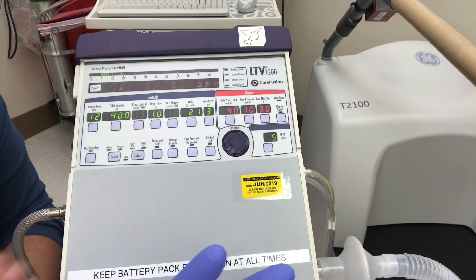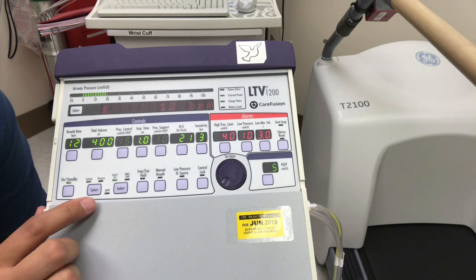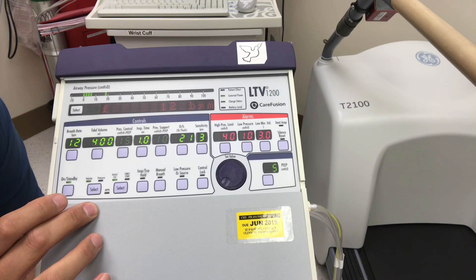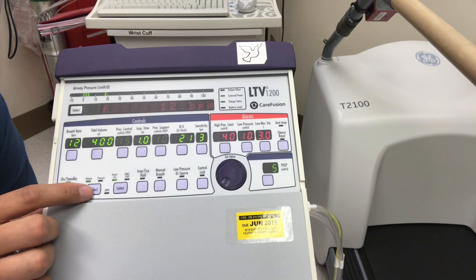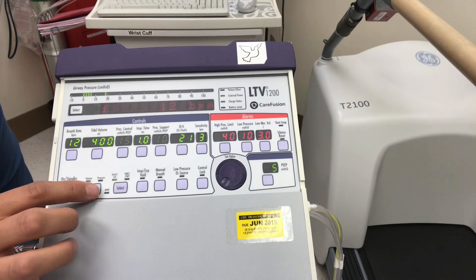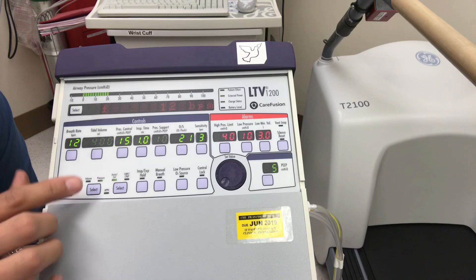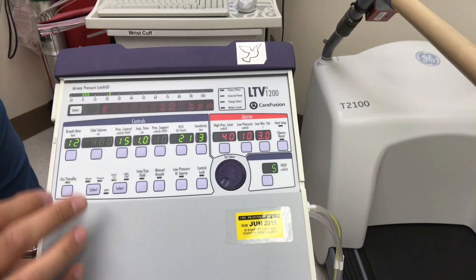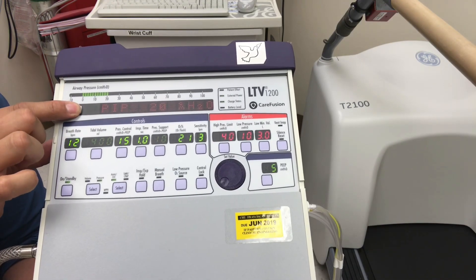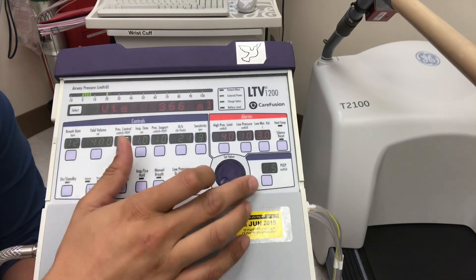Let's change some settings. We have assist control dialed in with volume and pressure options. To switch to pressure control, first select the control type and go from volume to pressure — we're going to set a pressure instead of a tidal volume. Hit the button once, then twice, and it stays. Now we have our pressure control setting. To monitor tidal volumes we'll toggle to VTE, the exhaled tidal volume.